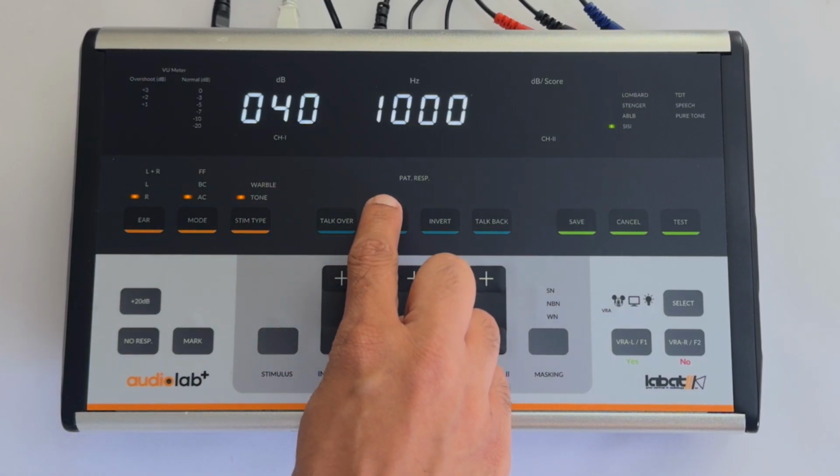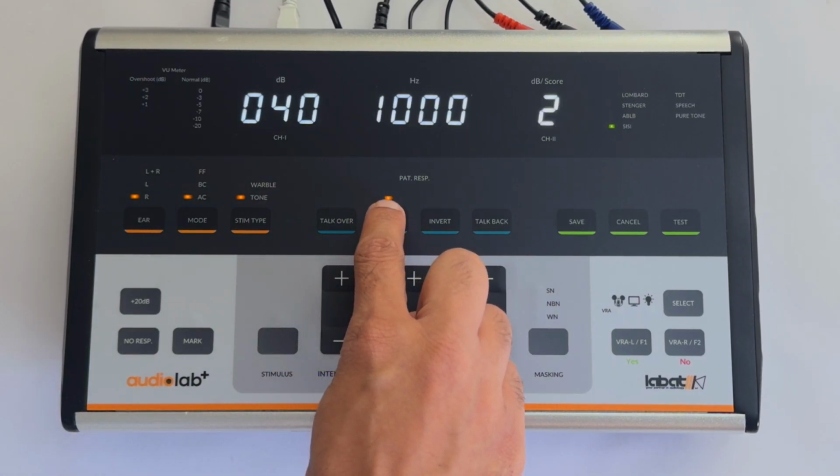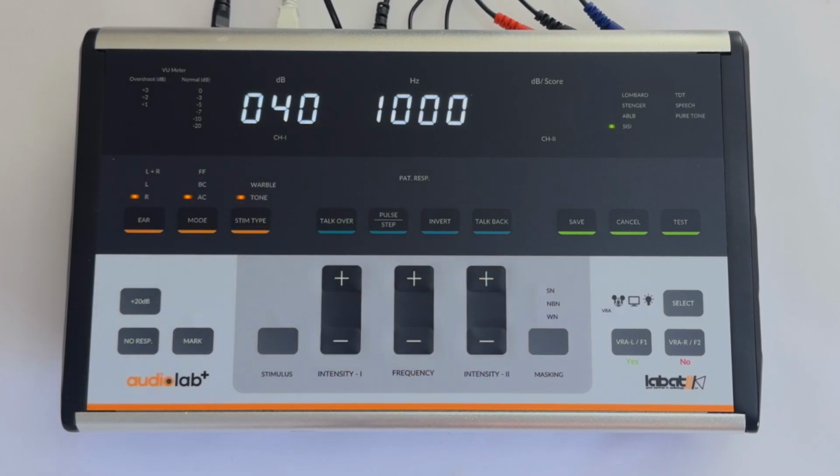An increment of 5, 3, and 2 decibels is used for practice of patient. An increment of 1 decibel is used to test the patient. Then, set the intensity and frequency according to the patient's hearing threshold. Press stimulus to start the test.